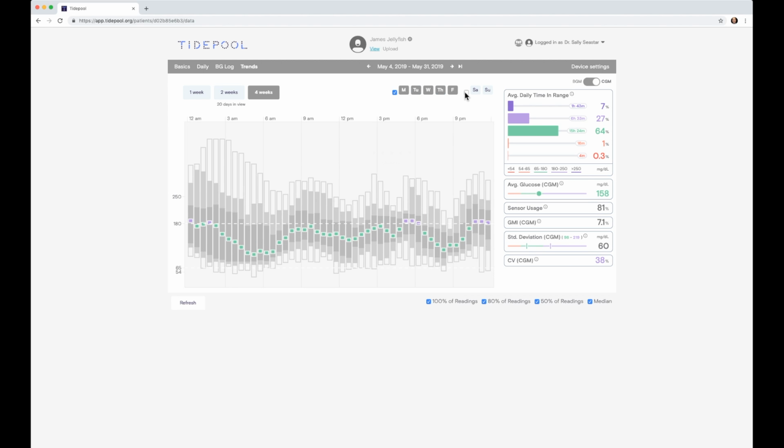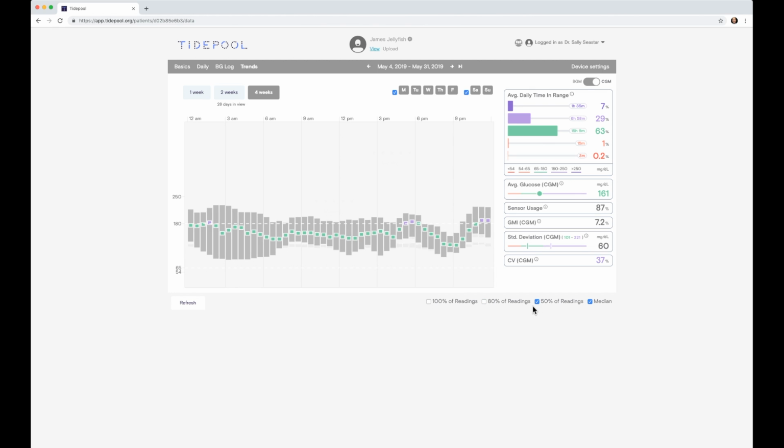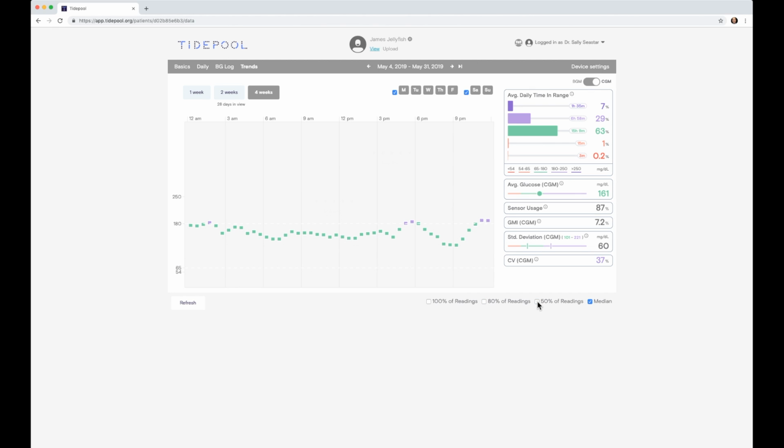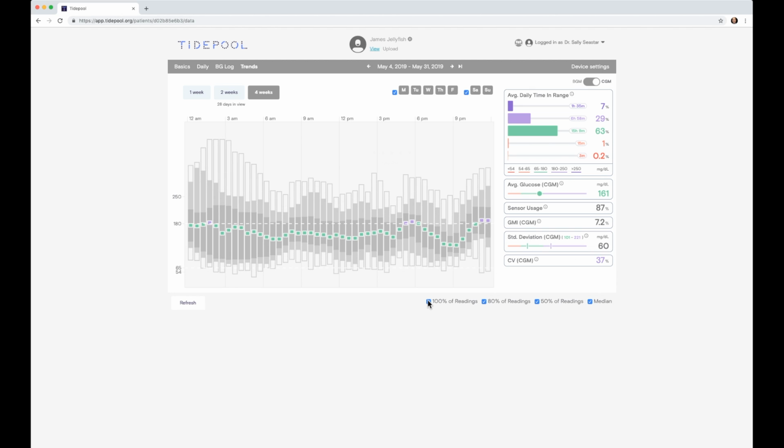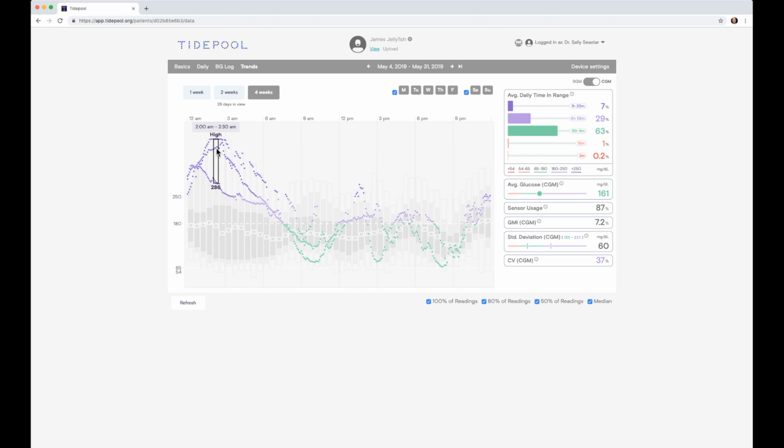Lastly, we can also use the different options down at the bottom to focus the data presentation to just show the median of CGM data over these different time periods, where 50% of CGM readings are taking place, where 80% of CGM readings are taking place, or 100% of all CGM readings to see where all of those data outliers are currently occurring. We can also hover over any portion within the trends view to identify, within this half-hour time block, the CGM lines that are contributing to that data view.